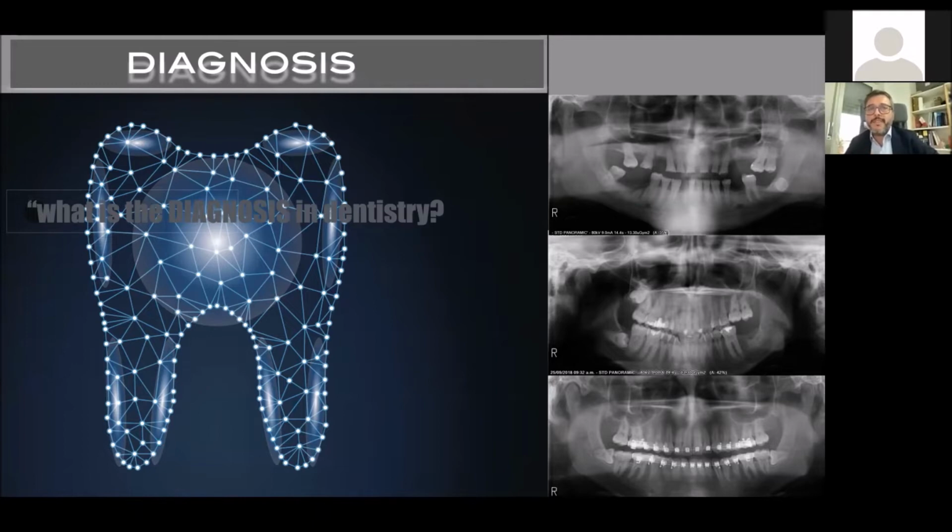Pathological radiographic changes are usually discrete, and therefore clarity and detail are essential. For dental radiography to be used for diagnostic purposes, it should be an accurate representation of the size and the shape of the tooth, without superimposition of adjacent structures.